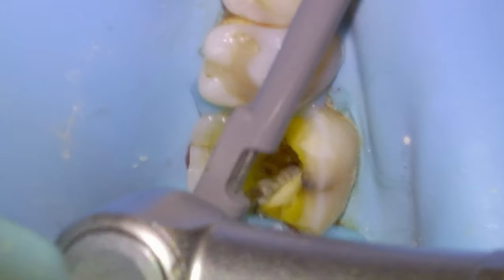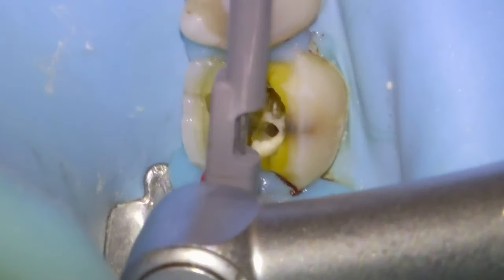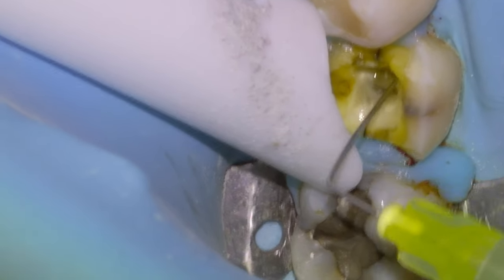Then we'll go in with our shaping files. I think we skipped the 1504 — this is a 2506, so this will actually be the last file to finish the prep. You may go to a 3506 or 3504 but I don't think it's included. Then we're going to use our endo activator to sterilize the canals all the way down to the apex. In necrotic cases I find it super important to get every file to the apex and then get a little puff out the end to ensure that the bone will heal back up around the root tips.